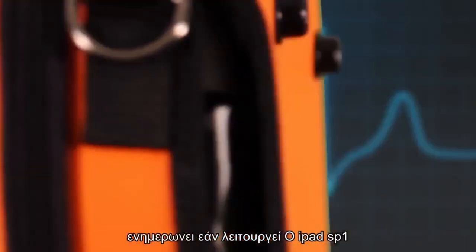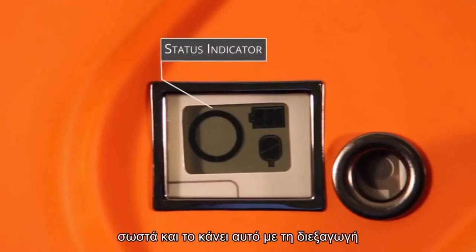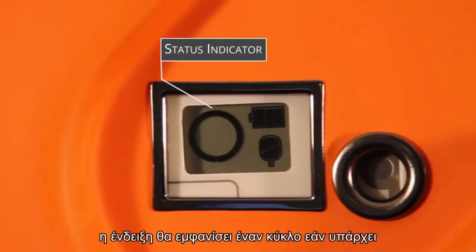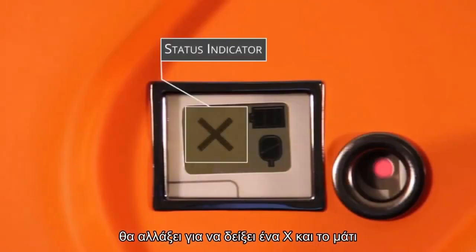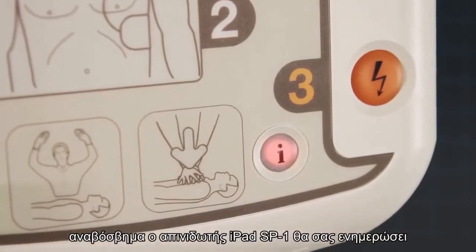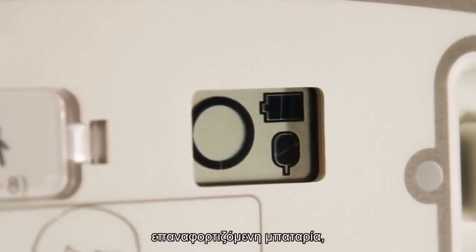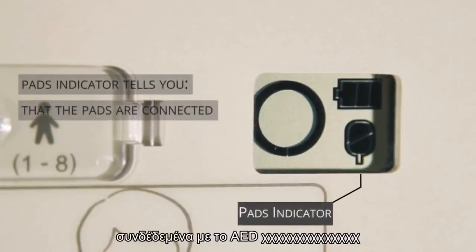The status indicator will indicate if the iPad SP1 is working correctly by carrying out daily, weekly and monthly self-tests. If all tests are passed successfully, the indicator will show a circle. If a problem has been found, the indicator will change to show a cross and the eye button will flash red. Press the flashing red eye button and the iPad SP1 will verbally tell you more about the issue. The battery status indicator informs you of how much battery power remains in the non-rechargeable battery. The pads indicator tells you that the pads are connected to the AED.